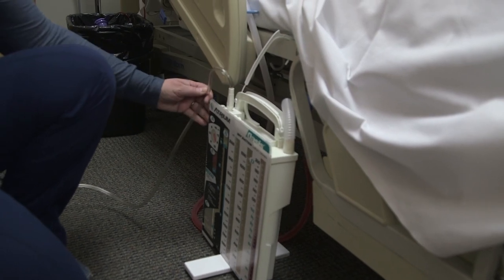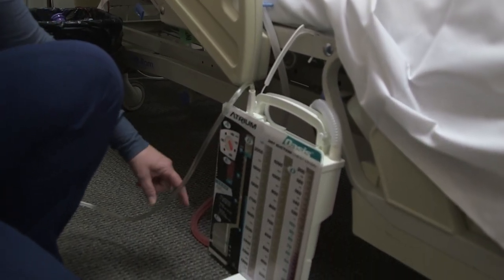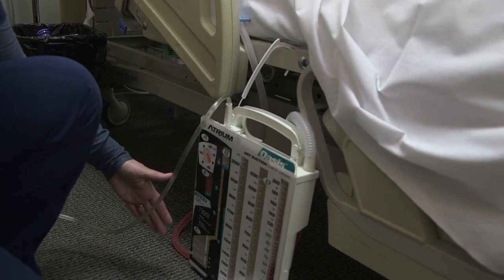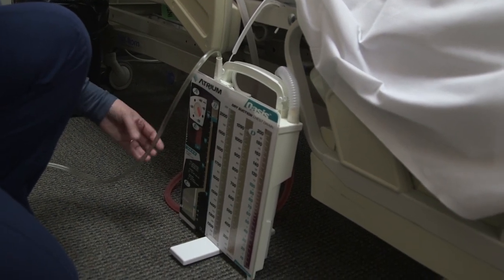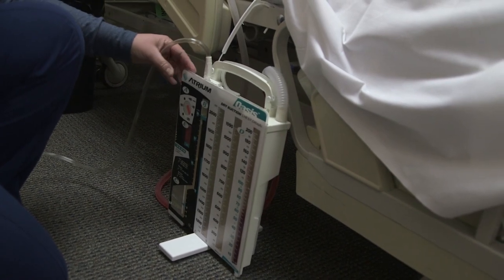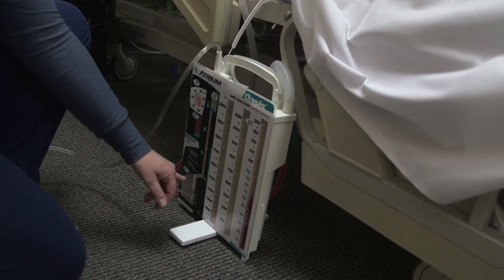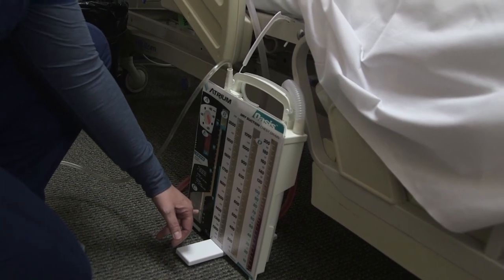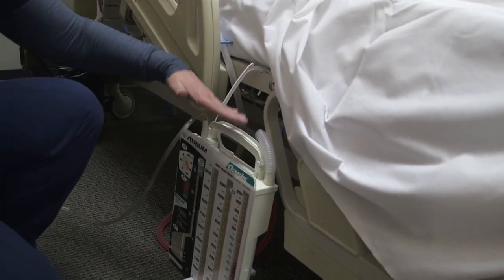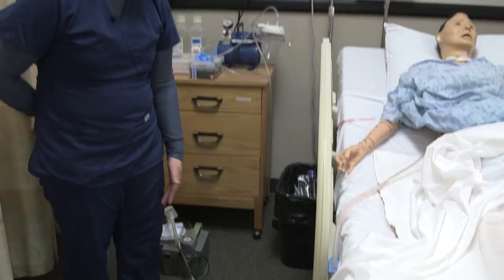With a dry suction system, this column should be located at minus 20 centimeters, which is indicated here. If it's hooked to suction, you may see some tidaling or bubbling when the patient takes a deep exhalation or is breathing. However, if it's not hooked to suction, you don't want to hear continuous bubbling in the water seal chamber. You also want to make sure the chest tube system is always upright and below the level of the patient's heart — if it's not below the level of the heart, it won't drain appropriately.